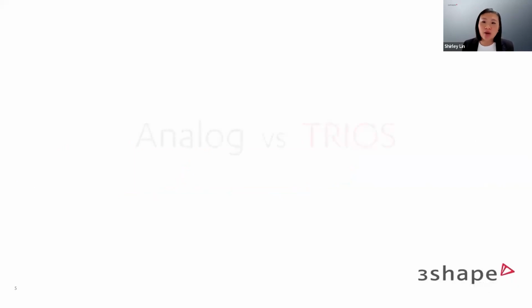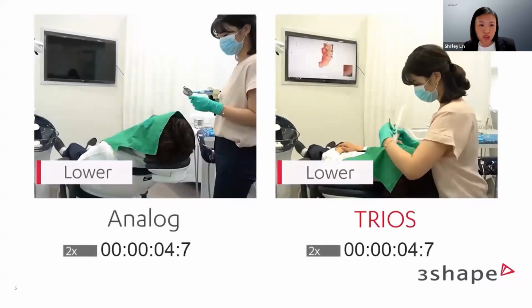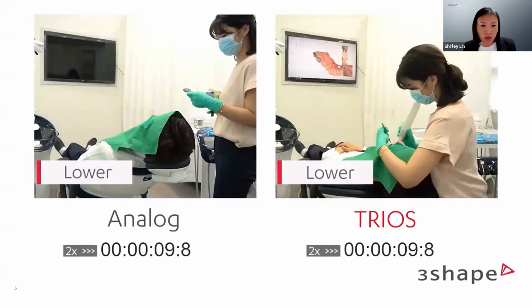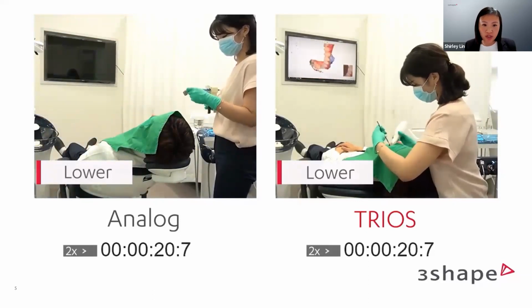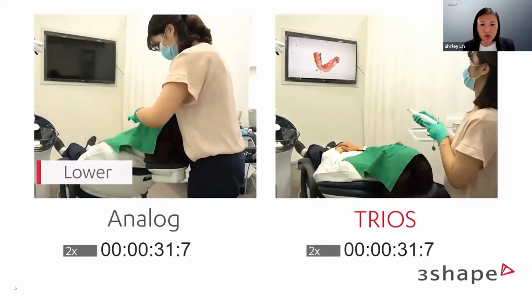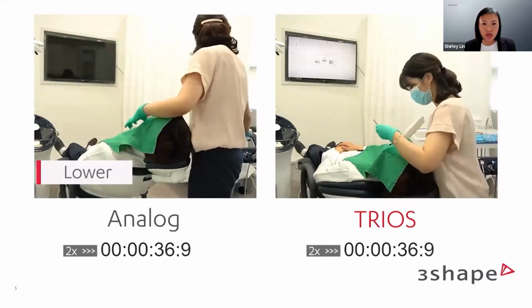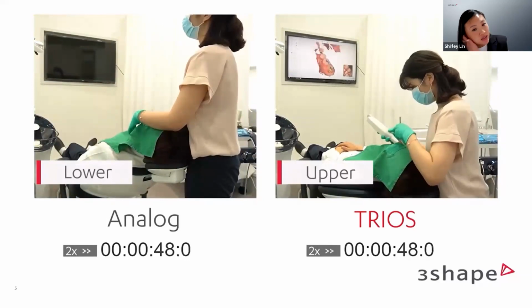So I'm going to show you a quick time comparison of analog impressions and intraoral scanning of a full mouth impression. Of course, we all know there are different variables with material set times and also the type of case. But just watching through this full mouth impression, you can see that she's doing her lower arch impression, almost finished, and she's still squeezing in probably her heavy body into that impression tray. Just watching through that, you can see in the Trios scan, she's actually now moved up to the upper and we're still on the lowers, waiting for their impression material to set.